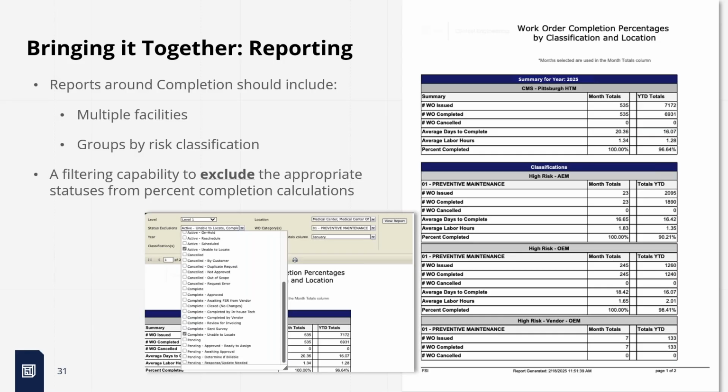Or is really doing your due diligence and looking for it quarterly or 2 times a year, or whatever your policy is? What are you really trying to do? When do you take it out of your inventory? Maybe your policy is, we didn't find it, so we don't have it. That could be it too. But it's ultimately in your policy how you handle that particular piece of equipment.